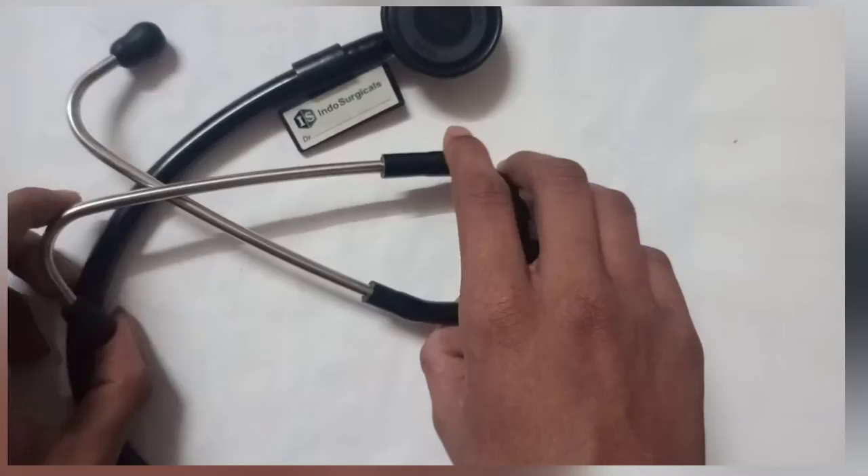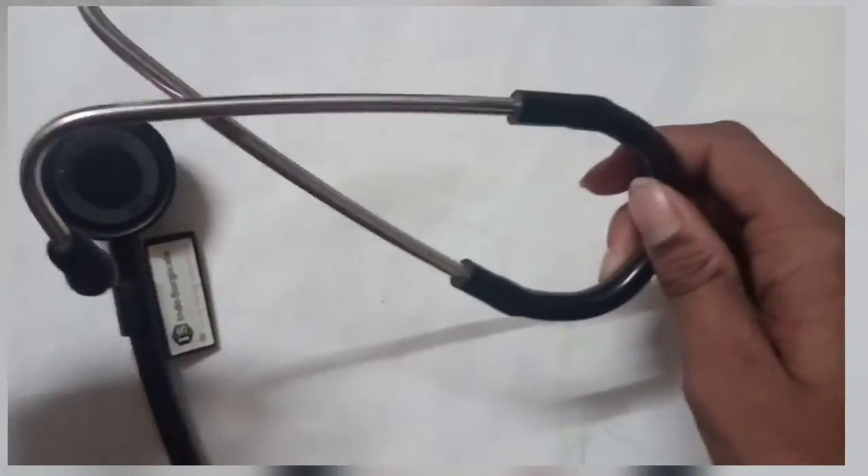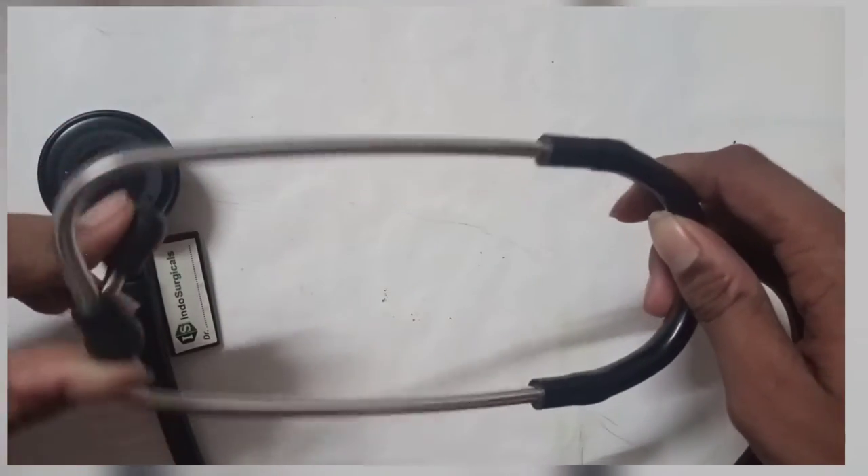This is the Stato Scope. I got this Stato Scope — it's really cool.